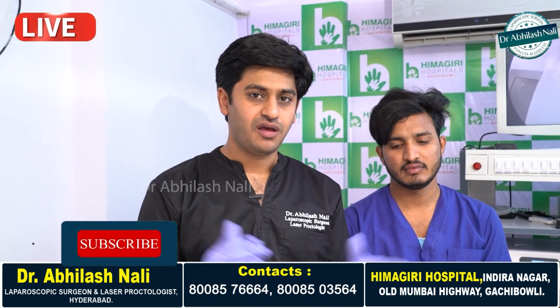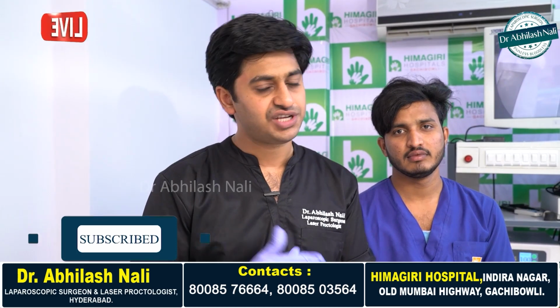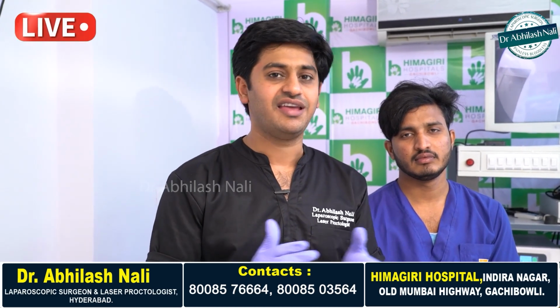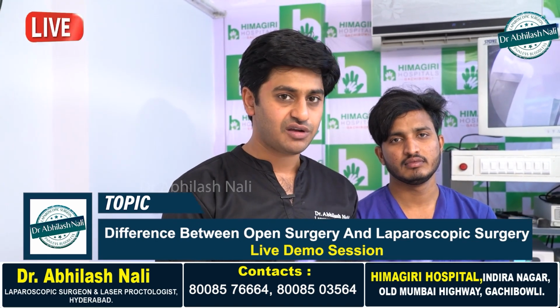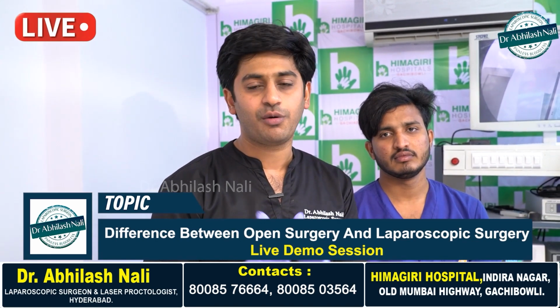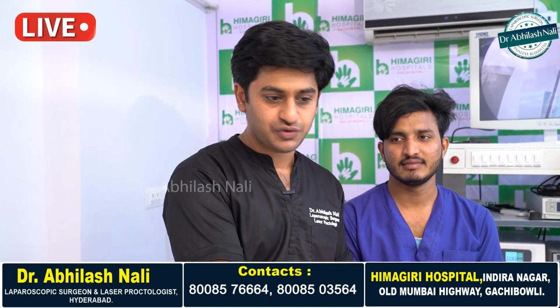In our previous videos, we have discussed a lot about the benefits of laparoscopic surgery over open surgery. But in this video, we are going to demonstrate live how open surgery will be performed and how a laparoscopic surgery will be performed on a virtual model.